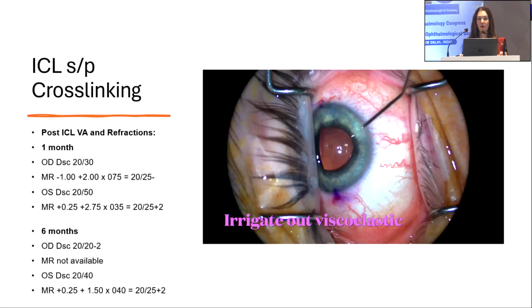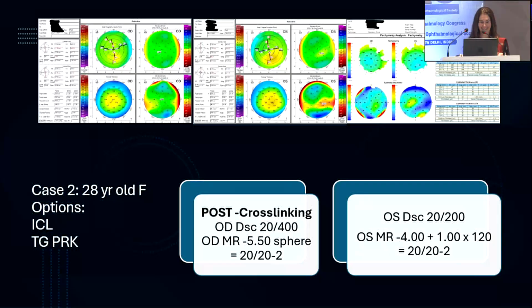You also have to counsel the patients that the goal is improvement and not perfection. We're talking about someone with a diseased eye, and I make that very, very clear, as well as the fact that they need to be patient. Of course, that's easier said than done.